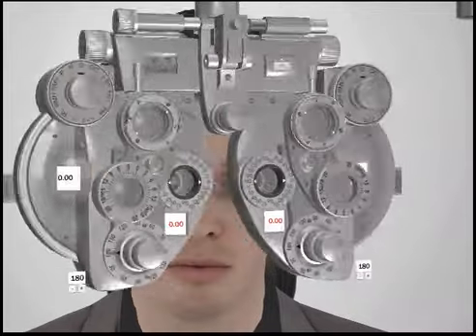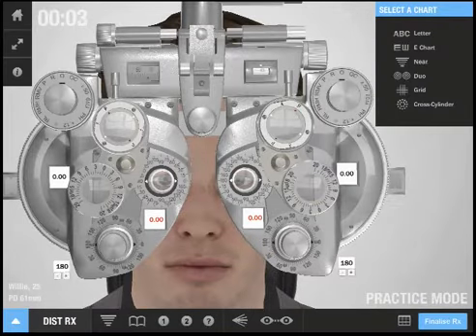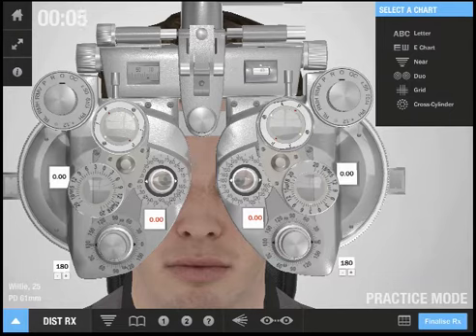Here is my patient. There are many different parts of the screen that I can interact with.